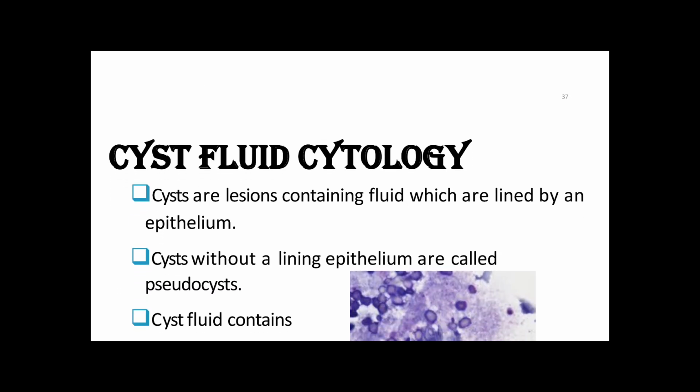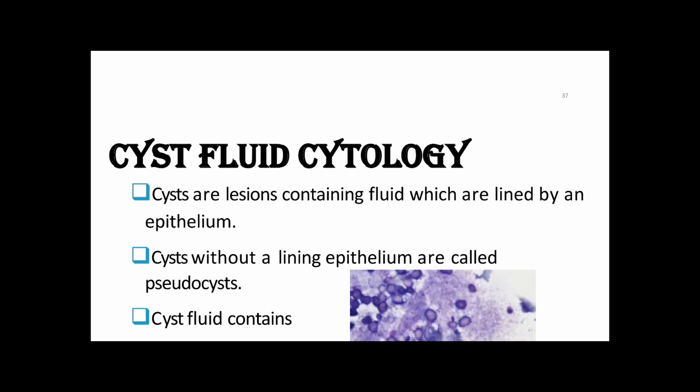Hello everyone. Today we are going to discuss cyst fluid cytology. Cysts are lesions containing fluid which are lined by an epithelium. Cysts without a lining epithelium are called pseudocysts. Right?